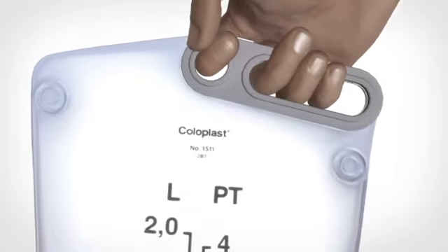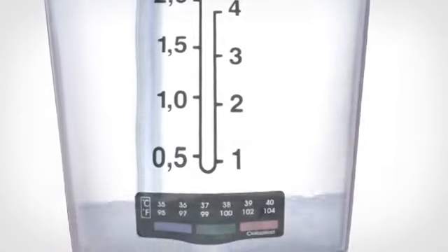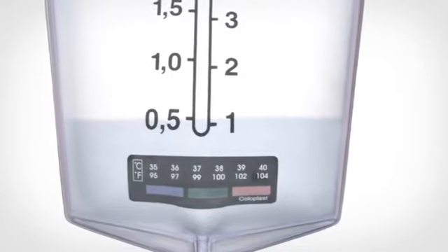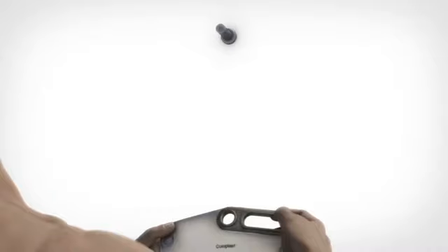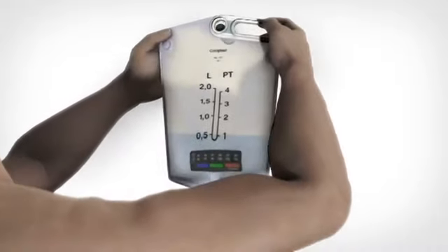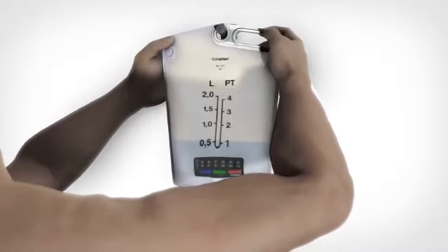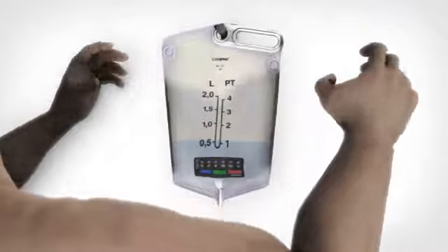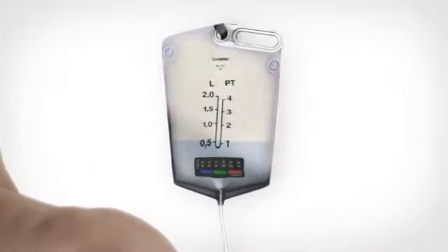Fill the irrigation bag with approximately half a liter of lukewarm water. During the irrigation, you can sit or stand as you please. Hang the water bag so that the bottom is at shoulder height. The higher you hang the bag, the faster the water will enter your stoma.